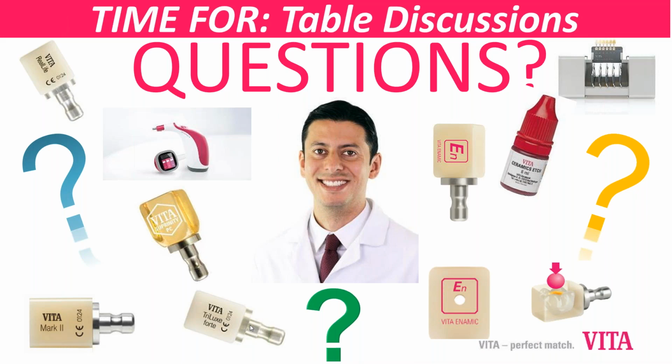To be honest, you can use the VITA Classic if that's the VITA material that you have, if it's a block. When I have a challenging case, I always get my 3D Master out. When I have something that is not so obvious, I go with the 3D Master because I know it's scientifically based and I'm going to be assured I'm within the value.